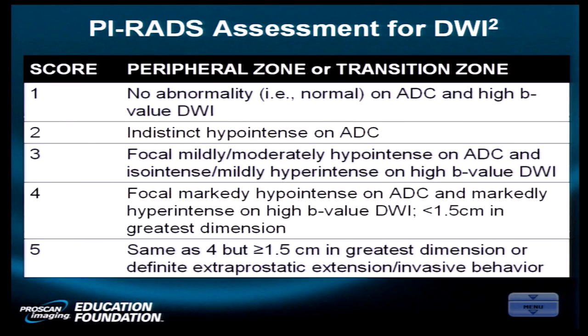All right, let's move on now to the next PI-RADS 2.0 designation, if you want to take a ride with us in this vignette, and that is the DCE MRI.